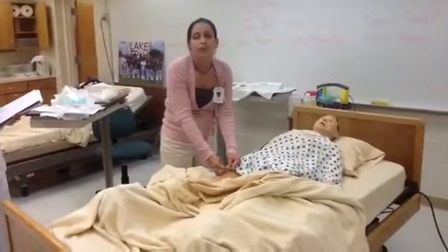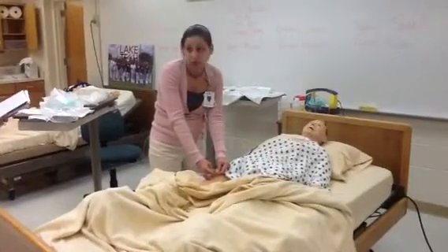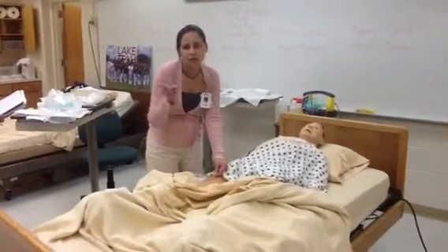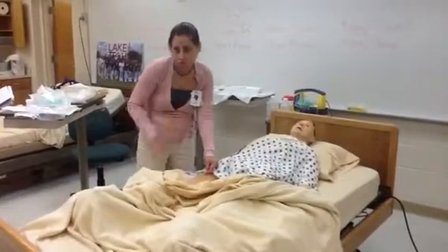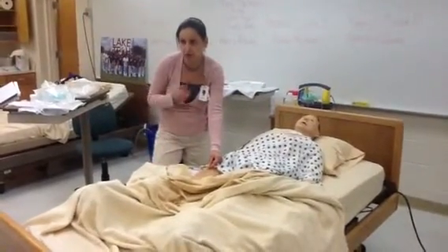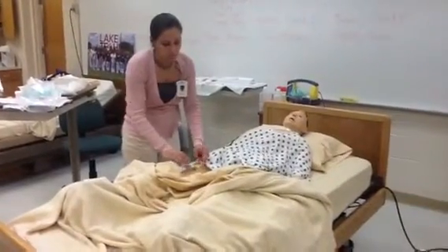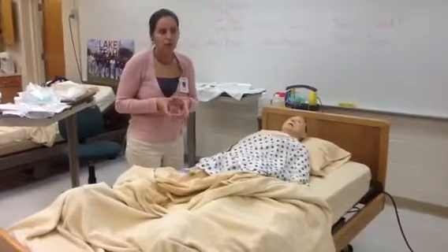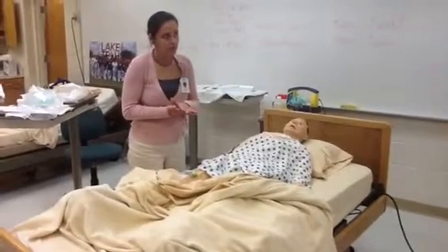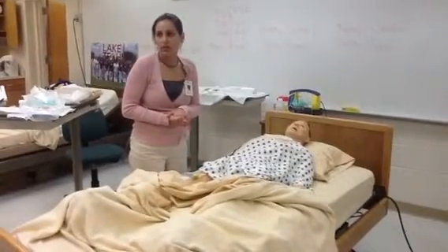Okay. Now, when we have the fancy clips that come in the hospital Garter sets, those are for leg bags for men that have catheters, or for females that have catheters that they're going to be going home with. It's a piece of pre-made tape with a hard plastic clip attached to it, and that's what we'll be using in the facilities more than likely.